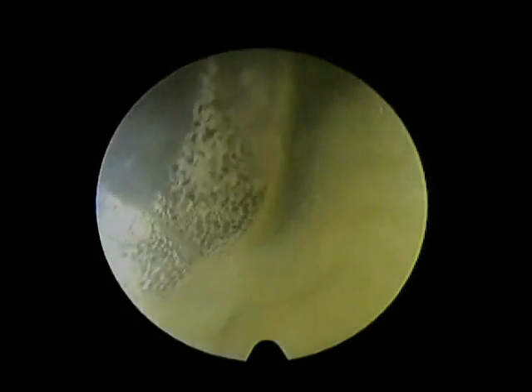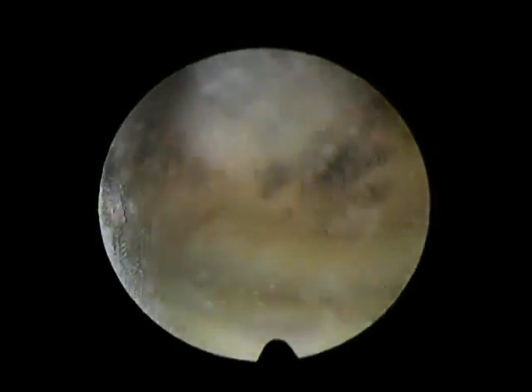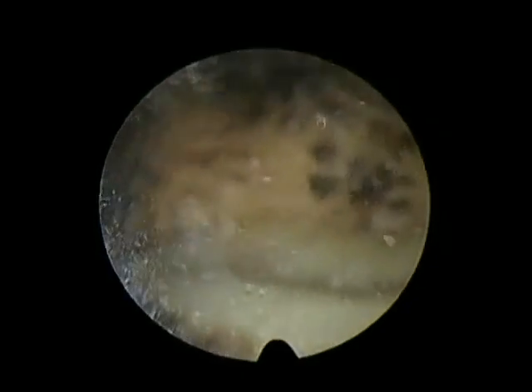Here's the chicken. Here's the upper hole, the bigger one. I got inside, slowly and gradually. I'm examining the inside of the chicken. There, you see, a little bit of saline. Here, the green is the chicken's gallbladder, and that brown is the chicken's liver. The yellow is fats. Here I'm trying to get inside the chicken through the lower hole, the small one indicated with the red arrow. I put it at 6 and here I was inside.